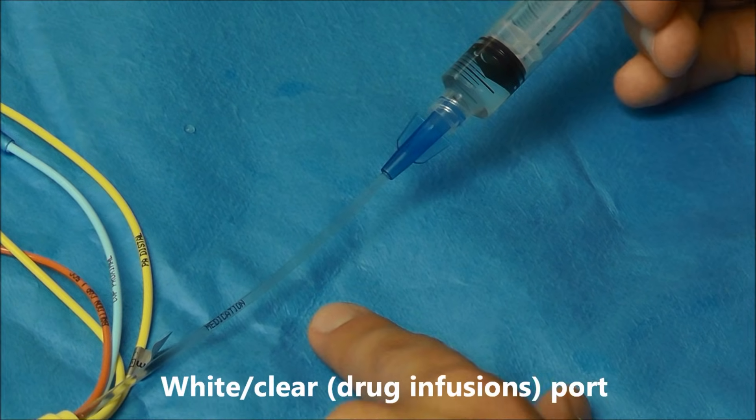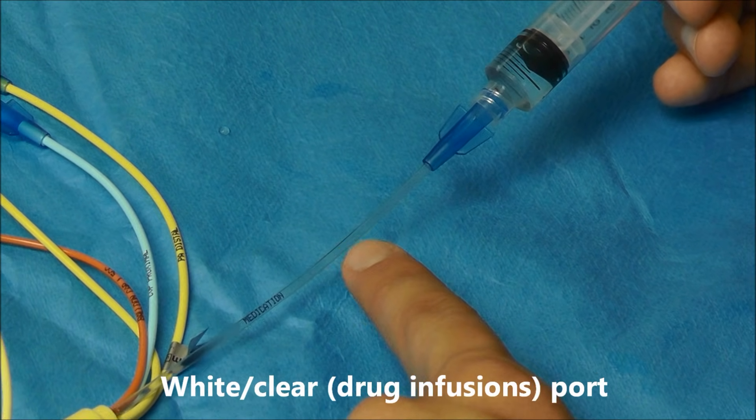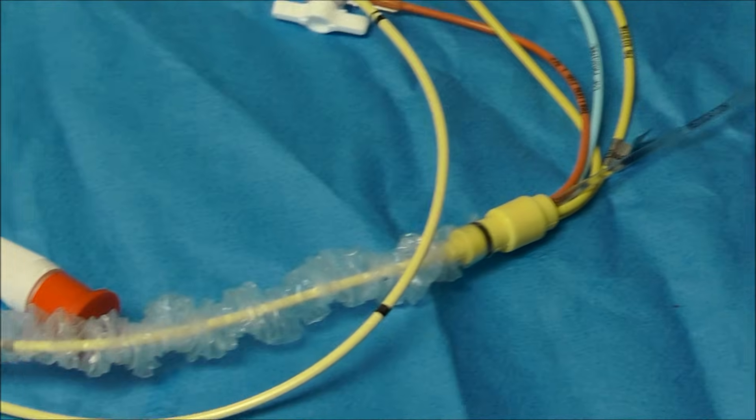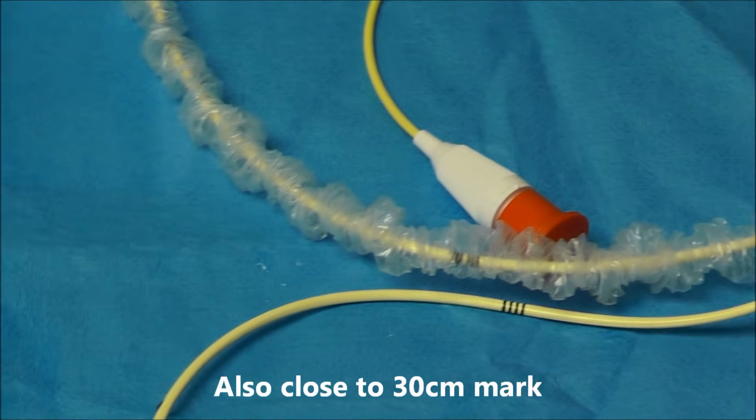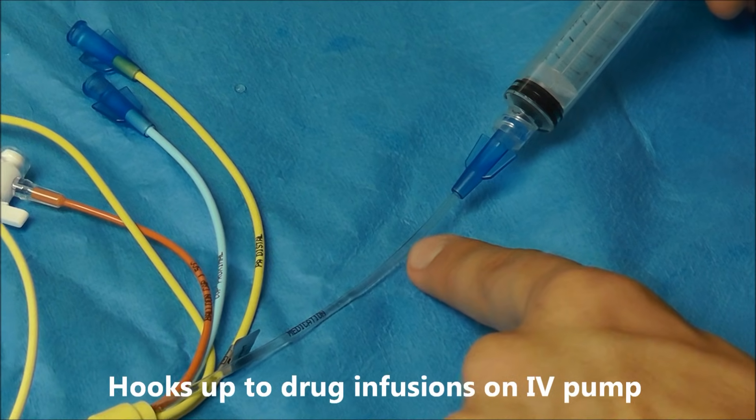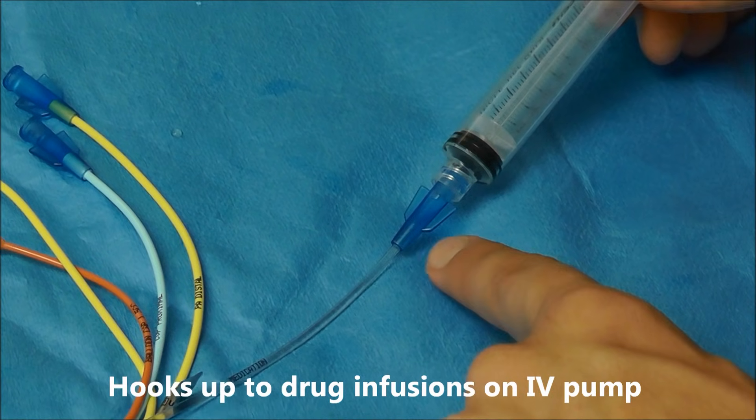The last port that I want to cover here is this clear port. And sometimes it's a white port. And this lumen is also proximal to the distal tip of the catheter. And it is roughly next to the CVP lumen. The purpose of the clear lumen or the white lumen here is for the connection of all of your cardiac infusion drugs.